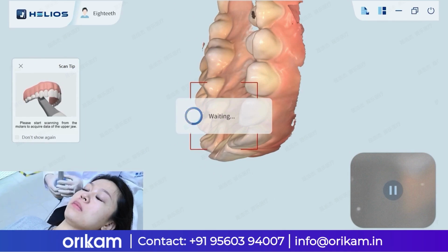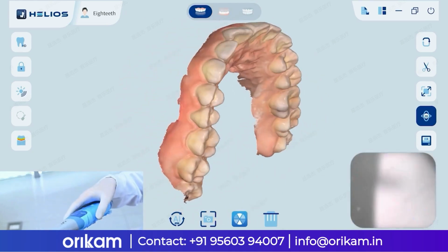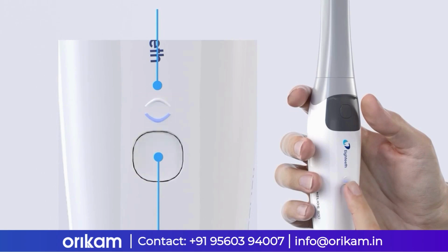After completing the upper jaw scan, use the remote control function to perform an initial review of the scan results. If any areas were missed, perform a supplementary scan. Use the buttons to switch modes and proceed with the lower jaw scan.